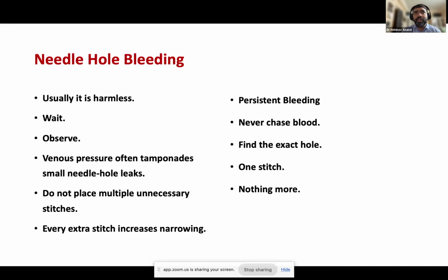but in a few cases, we have a thesis going on basically. We also have published a paper on the pressure measurements of the omental vein before splenectomy, post splenectomy, and post shunt. So, it is described, but we do not routinely do it in every case. But if we want to do a pressure measurement, we take an adequate omental vein, and we cannulate it with the pressure transducer with the help of the anesthesia team.